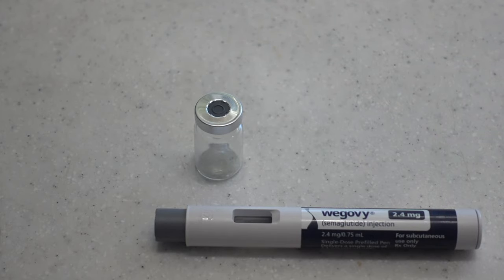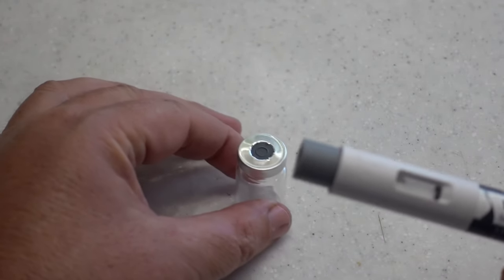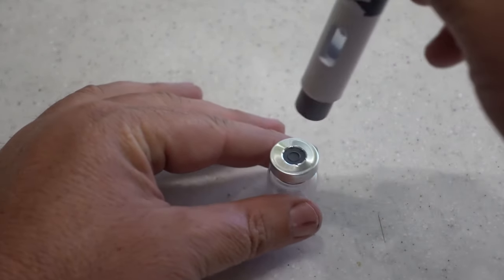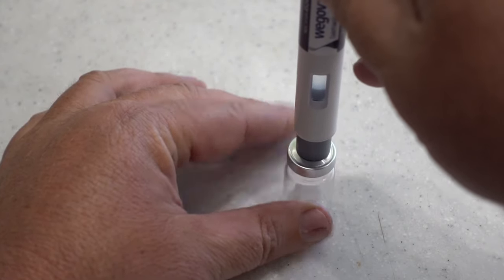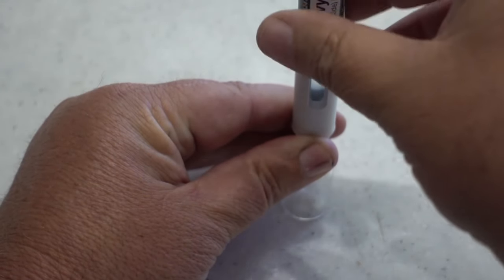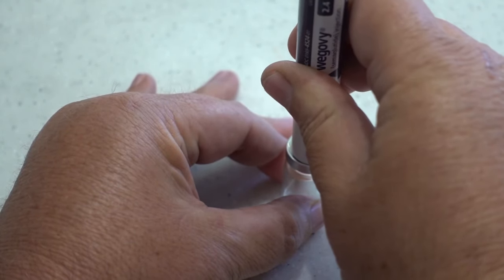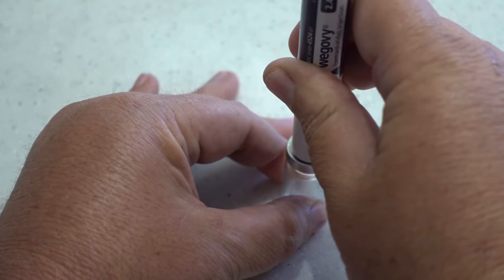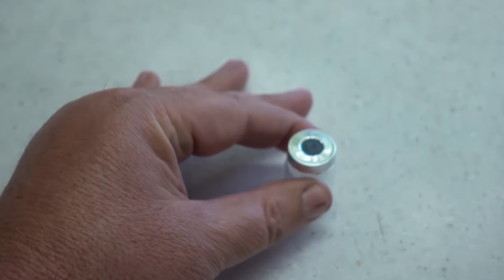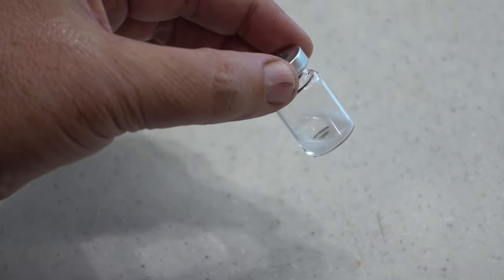This is the most critical part, which is the actual injection itself. You're going to want to line up the needle in the center of the pen, line this up with the center as best as possible, and then just push down on the injecting pen and hold it down until you hear the second click. Now you've just injected the prescription into the 5 milliliter vial.